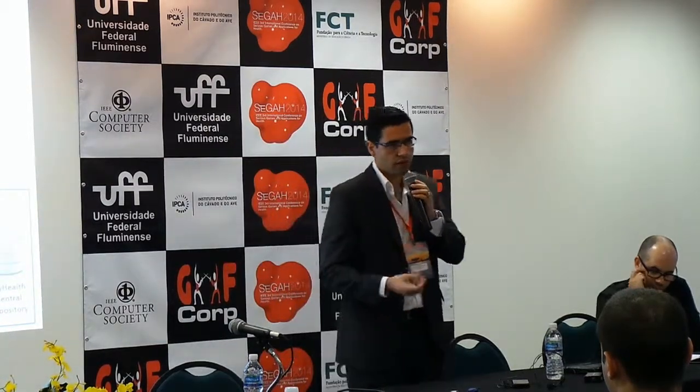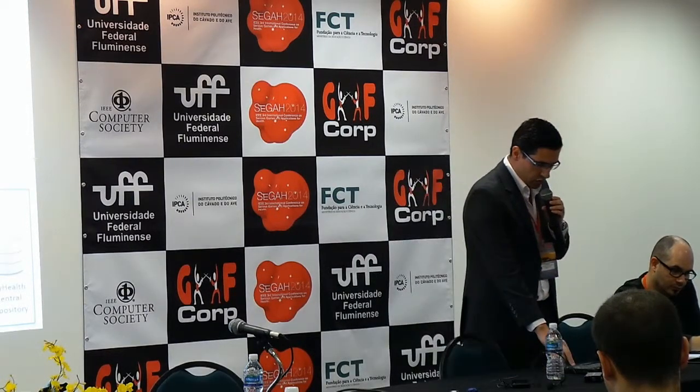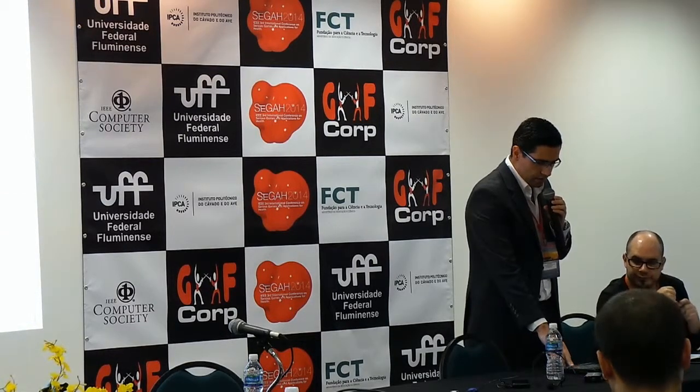This is called the My Health project, and there are several models that can send wireless data, or generally medical data, to a central repository where you can integrate all data from EEG, ECG, air analysis, and medical imaging analysis. All of that data is integrated in the whole system and can be visualized in a very integrative way, and lots of different aspects can be analyzed.